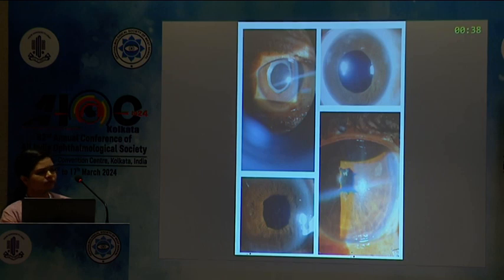These are the post-operative images of some of our patients who have undergone 4-quadrant sphincterotomy for a rigid, small, non-dilating pupil. There is minimal distortion of the pupillary architecture post-operatively, as the sphincter tears were planned and predictable compared to stretch pupilloplasty and other pupil expanding devices. Additionally, the pupil is almost round and regular post dilatation, serving the purpose of fundus examination in post-uveitic cases, and also reducing additional surgical cost of the devices and surgical time.